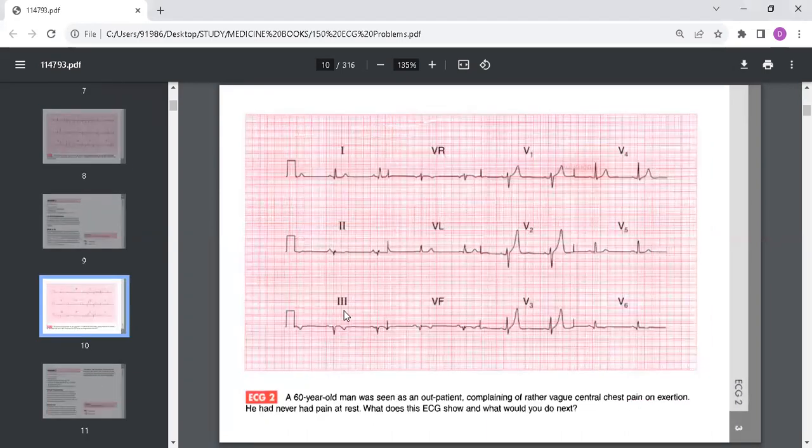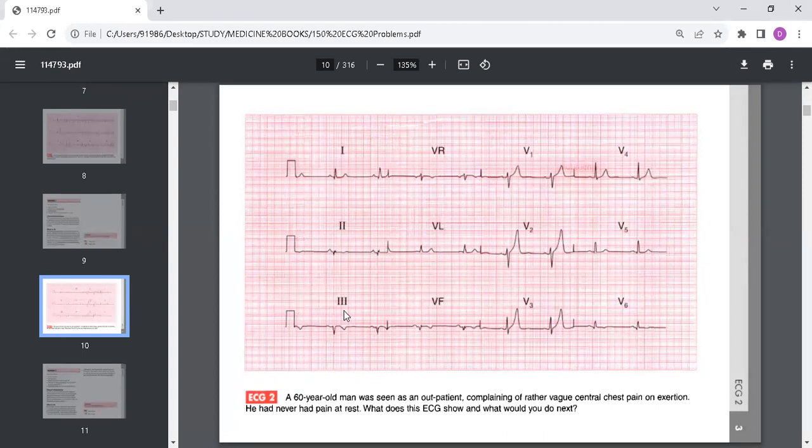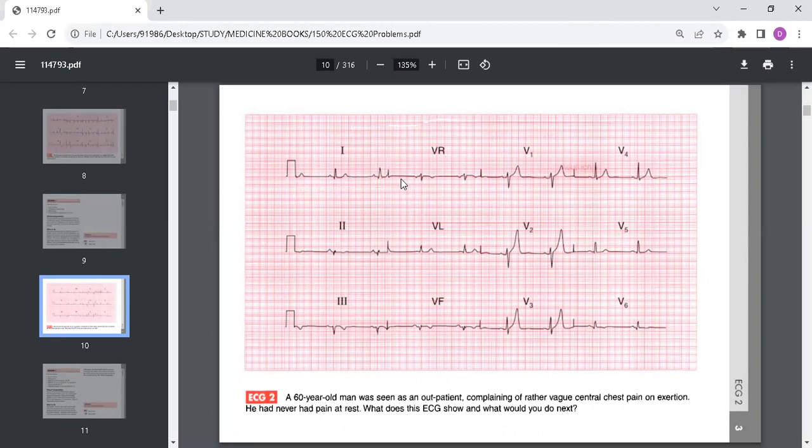The next ECG is of a 60-year-old man who was seen as an outpatient complaining of rather vague central chest pain on exertion. He had never had pain at rest. What does the ECG show and what would you do next?